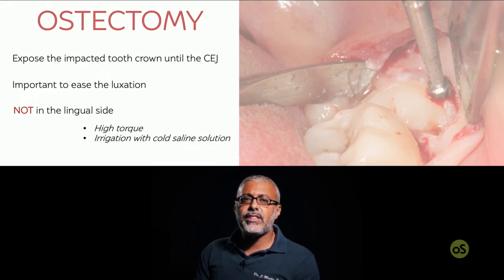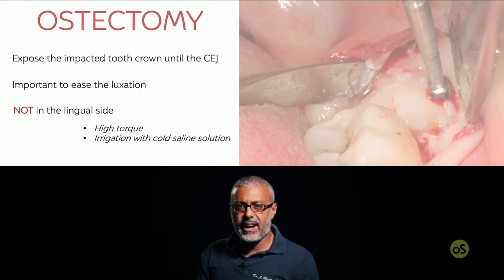apexes. I suggest not to use these round burrs that are used on straight handpiece under constant irrigation of saline solution on the lingual aspect, because these burrs can create damage of the soft tissues. So if we want to do some bone section and bone cutting on the lingual aspect, I suggest using a piezoelectric piezosurgery device, which doesn't cut the soft tissues but has a selective cut on the hard tissues only.